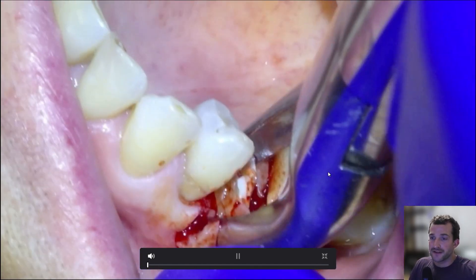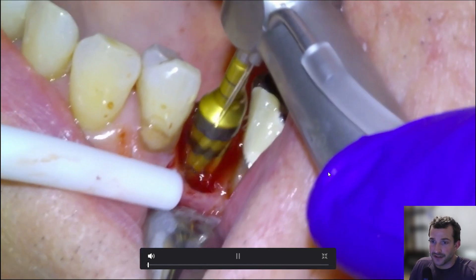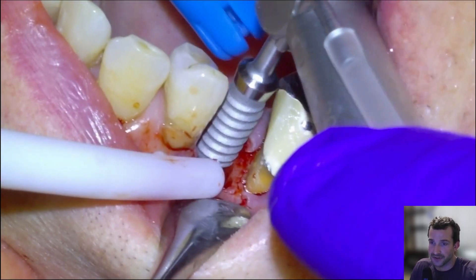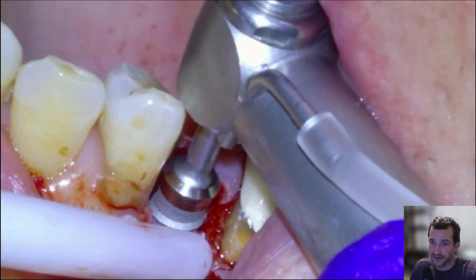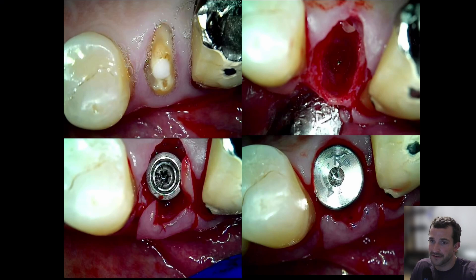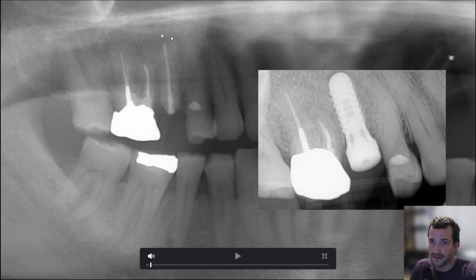Here's some teaser footage: easy extraction, osteotomy into the lingual portion of the socket, placed the implant 4.8 by 10 or 12, and then screwed it in. Here's a pan — you can see there's no pathology, very simple and straightforward immediate implant site for this #15, and here's the final result.